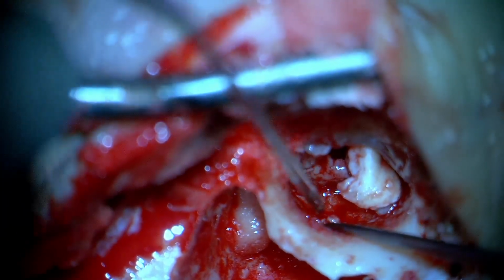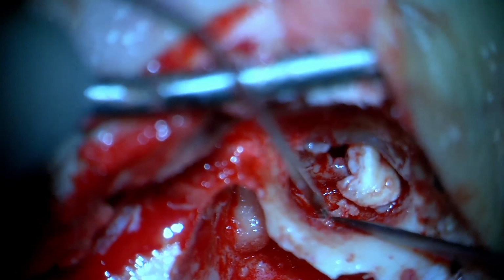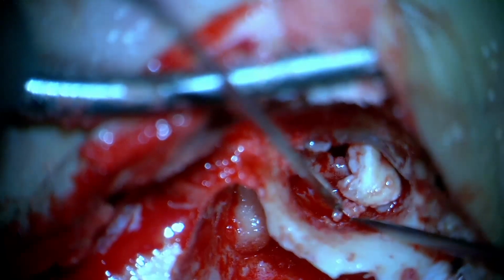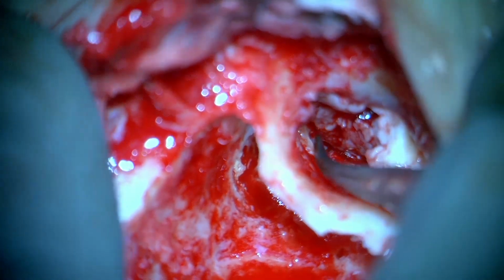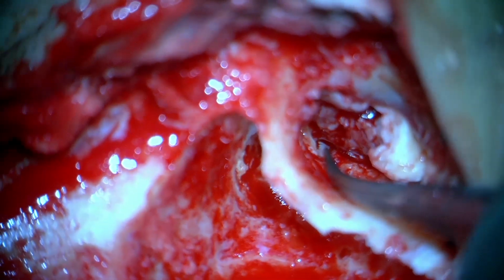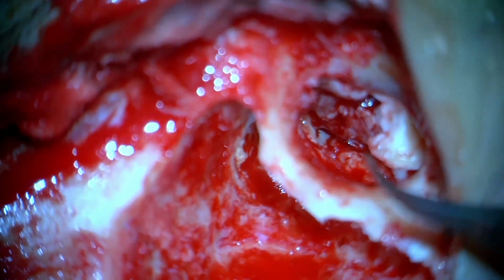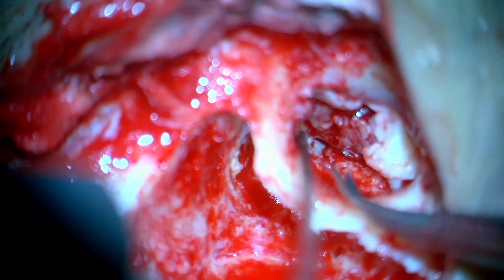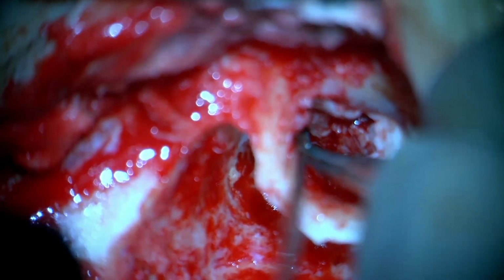Now you see here also a word of caution, that we are clearing off some granulation of the canal wall defect, but once again every bit of caution is required, because sometimes blindly removing tissue from this place, the posterior inferior region particularly, where the facial nerve can be even lateral to the annulus, could be very jeopardous to the facial nerve outcomes. So one must be very careful in these patients while doing disease removal.